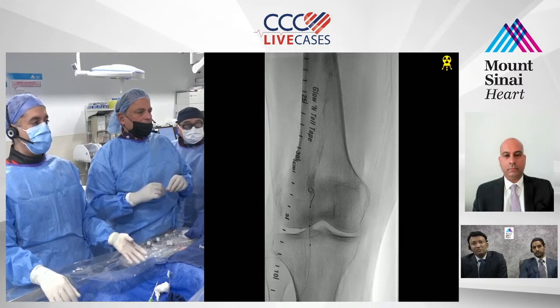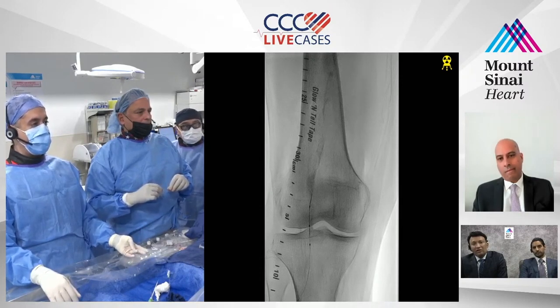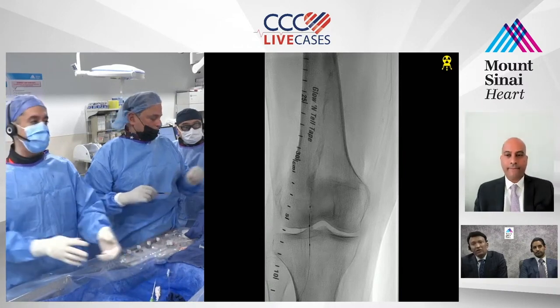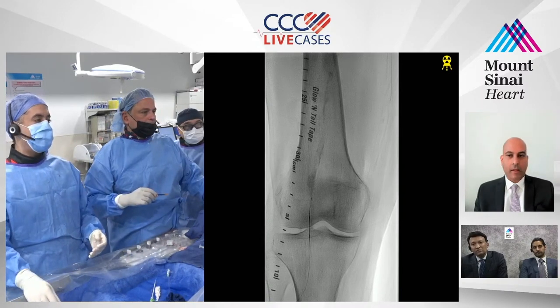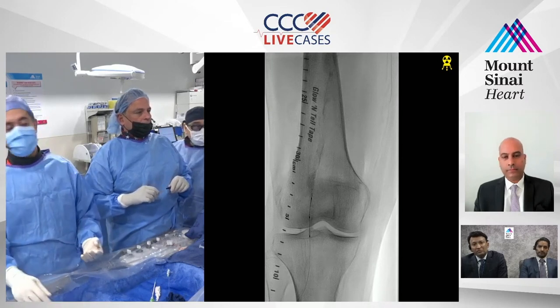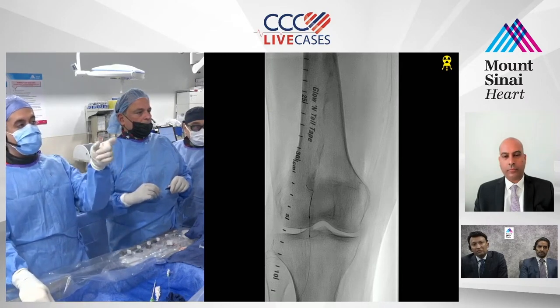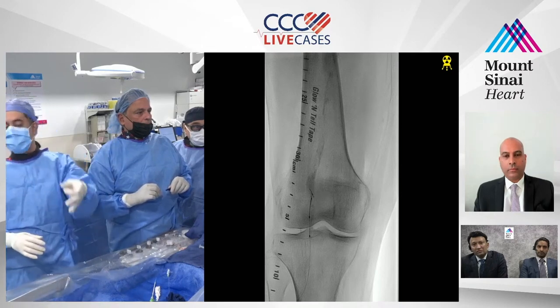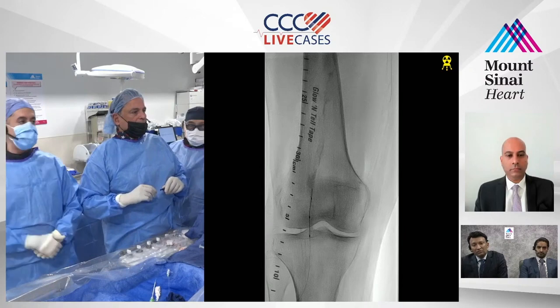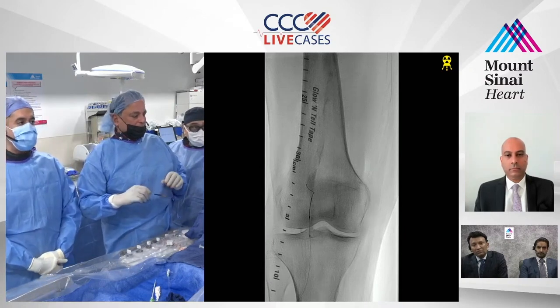It might end up being a multi-stage procedure. Yeah. We might end up doing the distal segment first, which is usually not intuitive. They would want you to do the inflow. But agreed. In this case, if we cross the CFA, but it looks the way it looks, I'm sure Ajit will tell you, like the calcification, the eccentricity, and the way it's cut off essentially at the CFA. It won't be that easy to cross over rather than having a chronic one. Yeah, cross. Yeah, I agree.